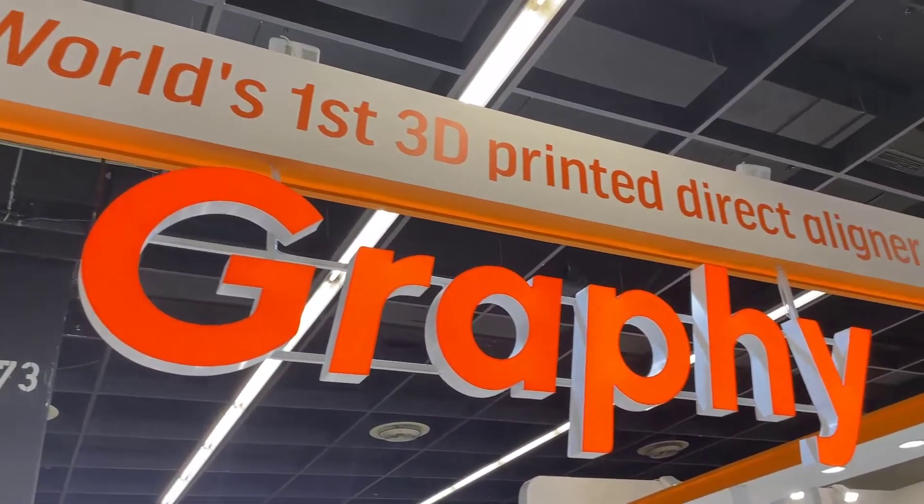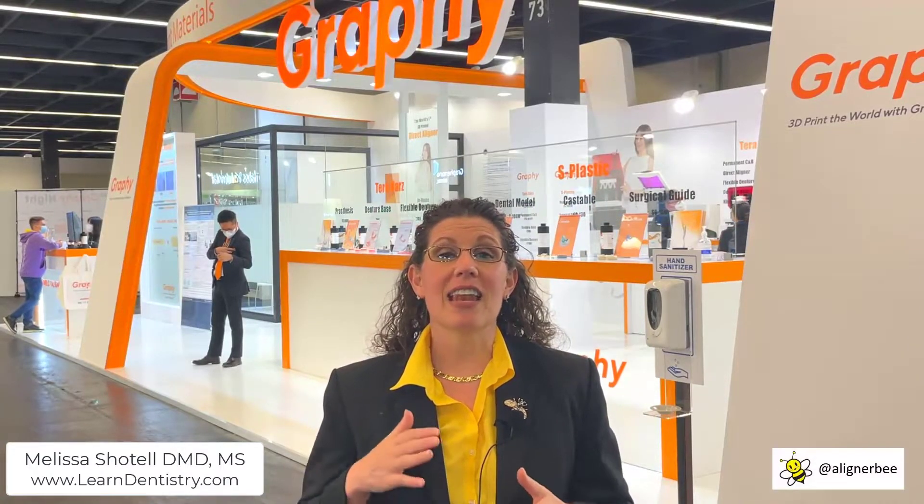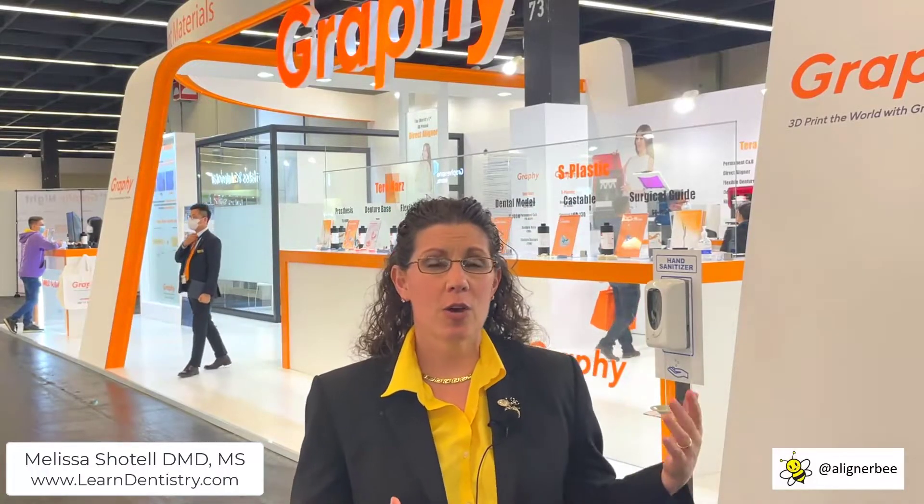Graphi is a really interesting company. They develop 3D printed resins, and Graphi claims that they have the first direct 3D printed aligner in the world, and the resin with the capabilities to do so. For many of us, we've been talking about being able to directly print clear aligners for years. For me, I personally refer to this as the holy grail of orthodontic treatment.